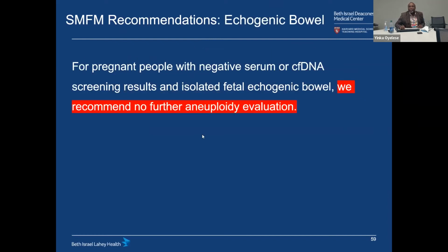Echogenic bowel, we recommend no further aneuploidy evaluation. However, when you see echogenic bowel, they do recommend testing for cystic fibrosis, for CMV, and follow-up ultrasounds to make sure the baby does not have a bowel problem.